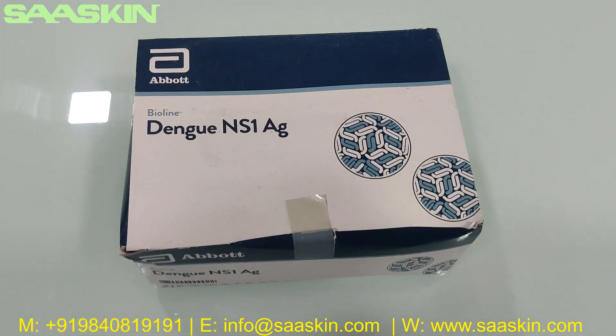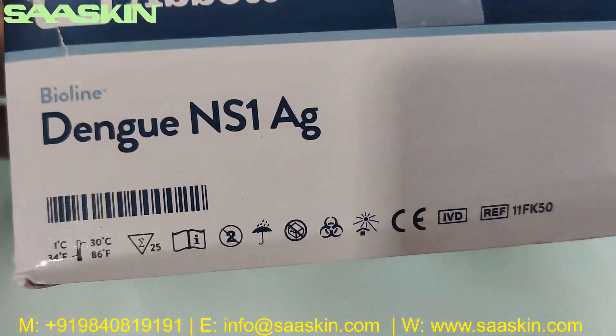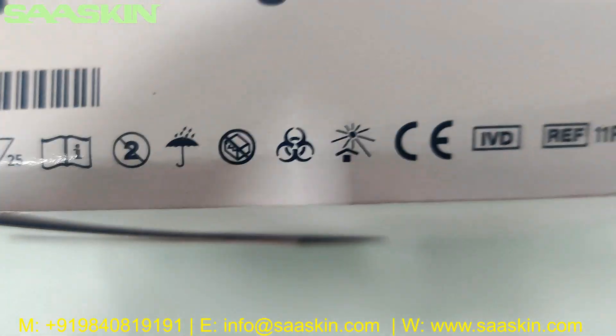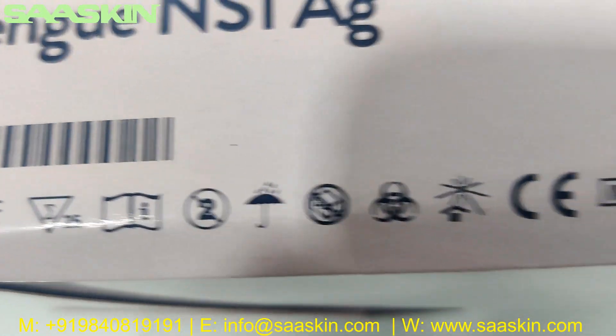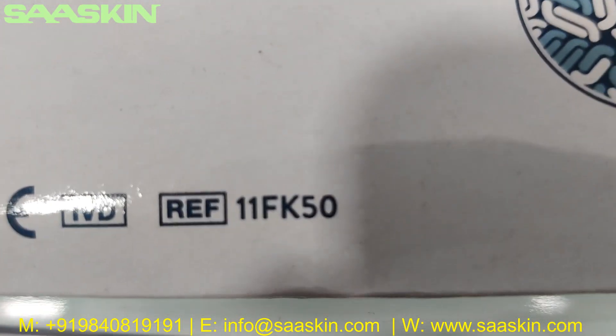You can see this is what the box looks like. It says Abbott Bioline Dengue NS1 Ag antigen test kit. This is a 25 test kit pack and is CE certified. The reference part number is 11FK50.